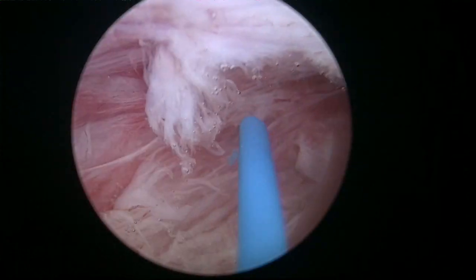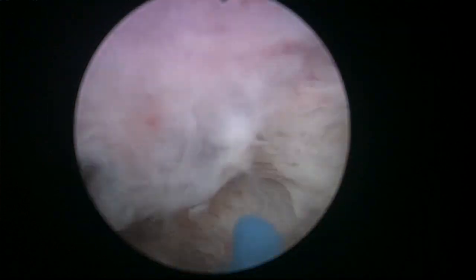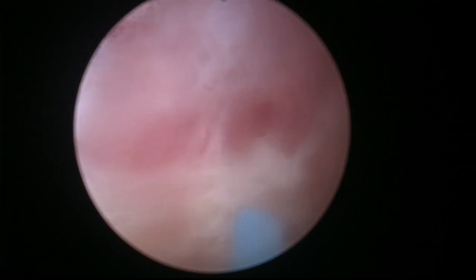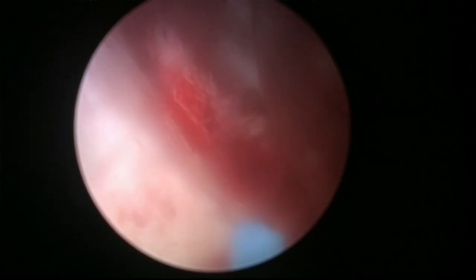You have to try to get good hemostasis before morcellation. And if you can't, then you go in with a rolly ball. Look at this, a posterior adenoma growing retrotrigonally, you see? Without entering the capsule, just by keeping close to the adenoma. If you don't get good visibility to morcellate, then you have to go in with a rolly ball and try to make it perfect, or make it better.